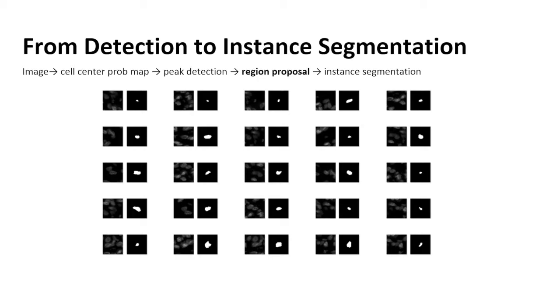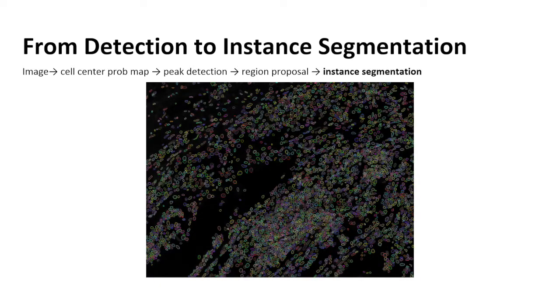So once you know that, you can look at the failure cases of your network for segmentation, and you can see maybe they're adjacent to another cell of some other type. This can guide your failure-driven development of the solution as well. The next stage is instance segmentation, which is again another segmentation architecture. You need to tweak it again, as Hakima described, the human in the loop in the annotation process and the domain knowledge process. There's still human in the loop at every stage of developing a neural network.